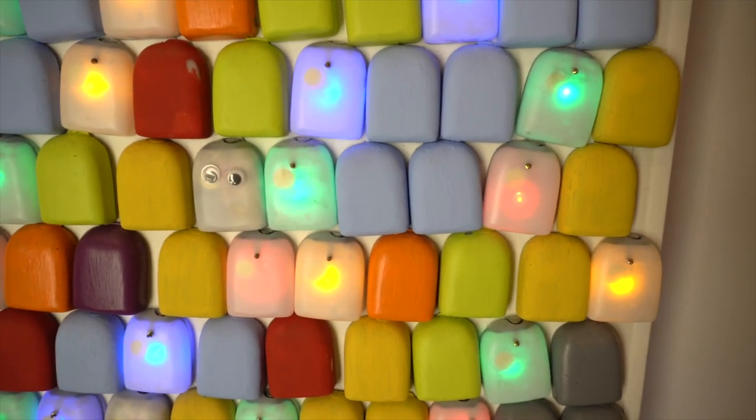Omnipod 5 is here! I am wearing the Omnipod Orange, and this can only mean one thing — we talk Omnipod. Omnipod 5 has just been approved by the American FDA. In this video, I am breaking down everything that you need to know about the Omnipod 5, how it works, and a lot more.